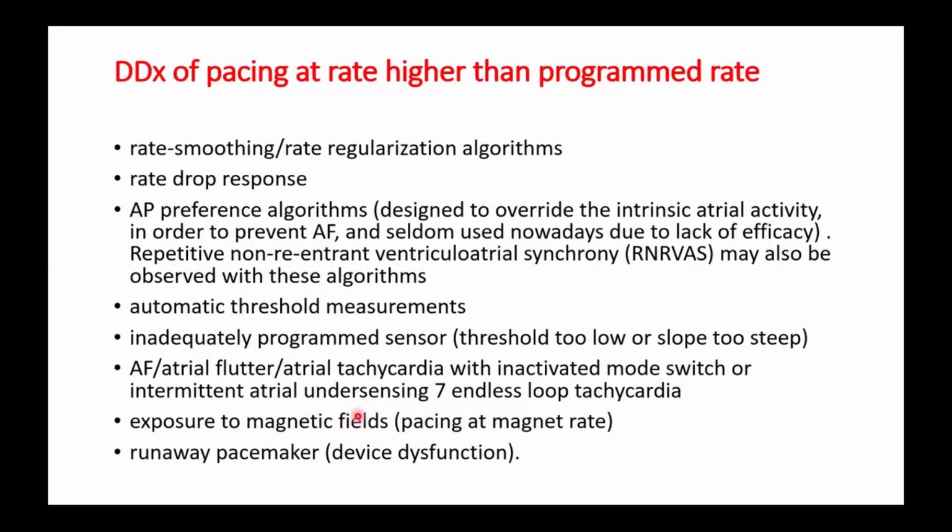Very rarely, there is a dysfunction called a runaway pacemaker, which is some sort of dysfunction in the circuit, which may lead to pacing at a very high rate, ventricular tachycardia, or it may be of very low amplitude.